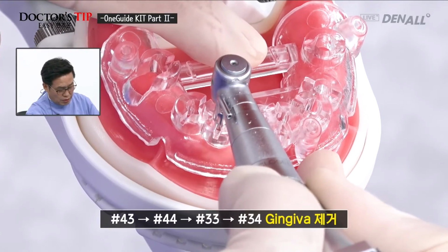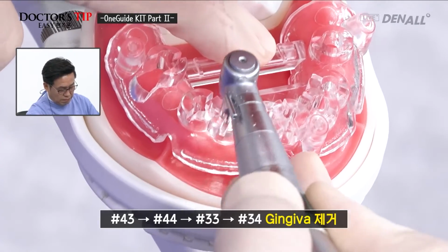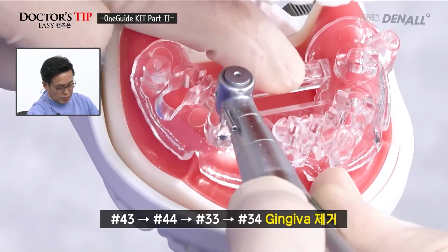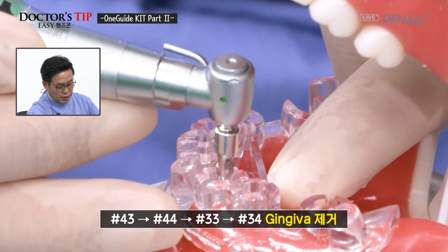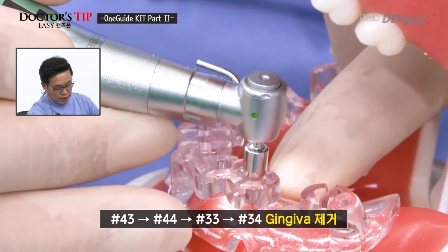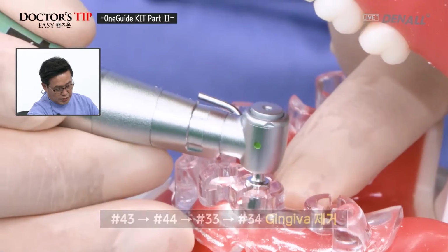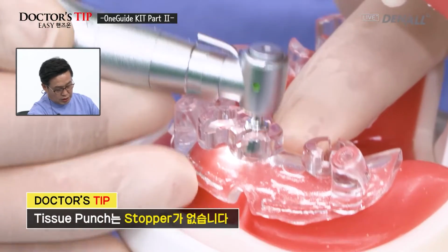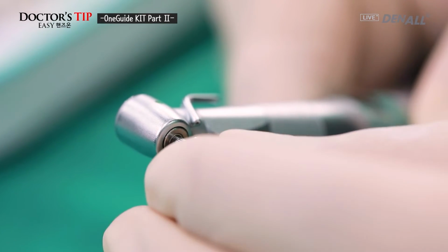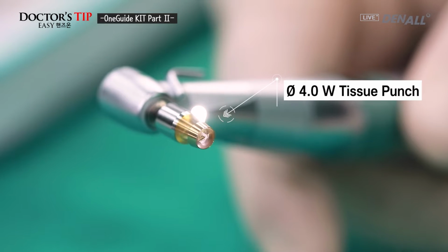Number 43, punch is done. Next, number 44, punch is done. Next, number 33, punching is done. Next, number 34, tissue punch is done. As mentioned earlier, there is no stop for tissue punch. 4.0 wide tissue punch is used. Number 6 on both sides, tissue punch is done.